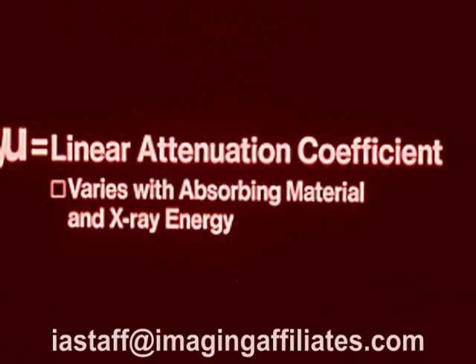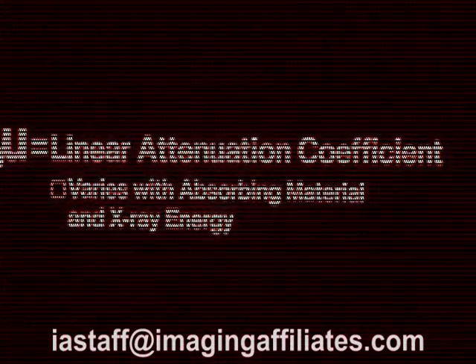The ability of a particular material to attenuate an X-ray beam is characterized by its linear attenuation coefficient. The numerical value of mu, with units of per centimeter, represents the probability that a photon will be absorbed for each centimeter of tissue traversed. Each type of tissue has its own value for mu, but this value is also dependent on the energy of the X-ray. Consequently, linear attenuation coefficients are for a specific energy and will change as the X-ray beam energy changes.